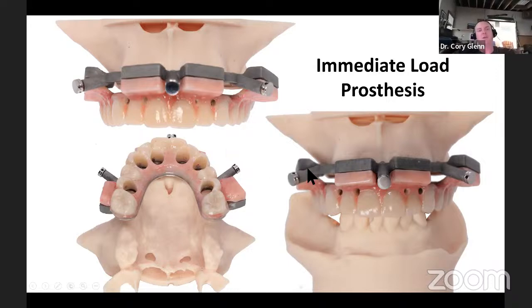So what this lets you do is, instead of trying to put it in between your cylinder and your temp, you literally just stick the tip of your dual cure in there and start injecting, and it gives you some hydraulic pressure, so you actually get a denser fill around your cylinder.